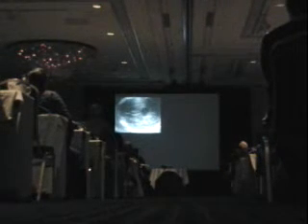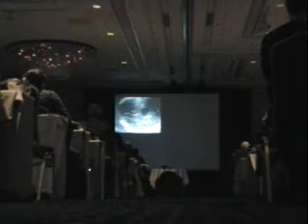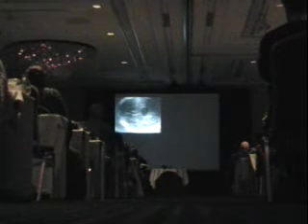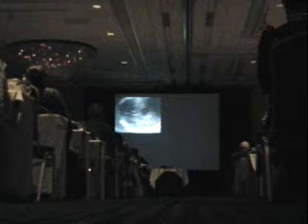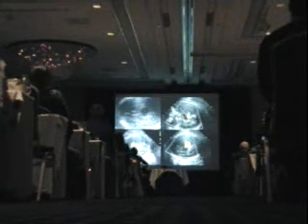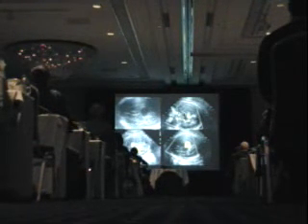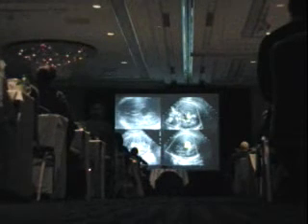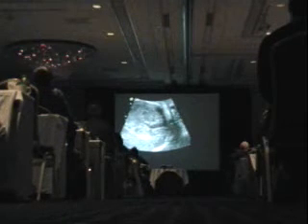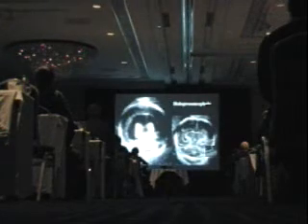I'm just going to pass due to time here and just show you this other cyst right here. This may look like an arachnoid cyst and could be mistaken for an arachnoid cyst, but what should we always do here? Color, absolutely. This is an AVM or a vein of Galen aneurysm. These are devastating. Fetuses that have this die. They go into severe heart failure. You don't even have to use color sometimes. If you see the vein connecting, you can just look at it in real time.